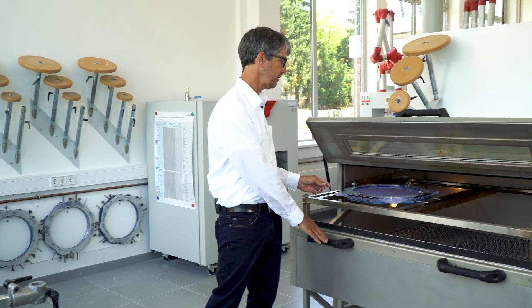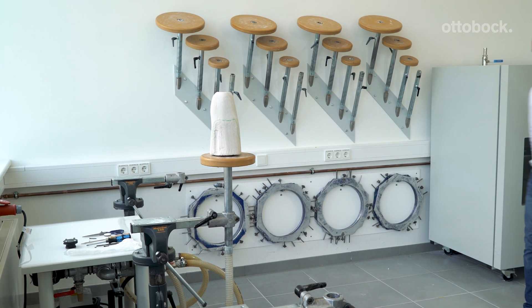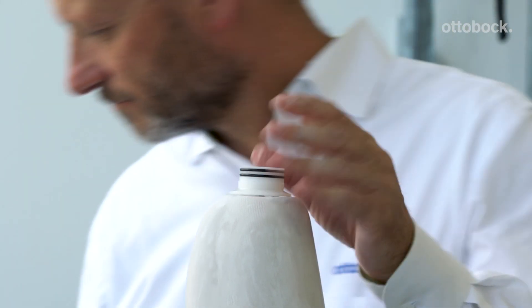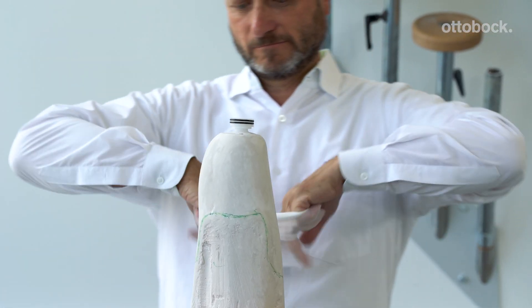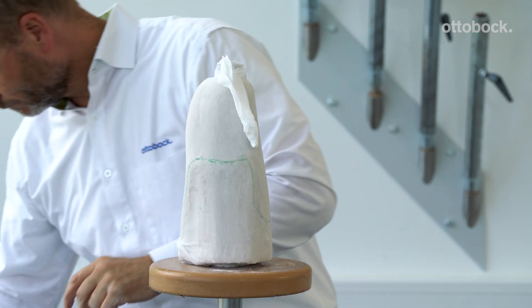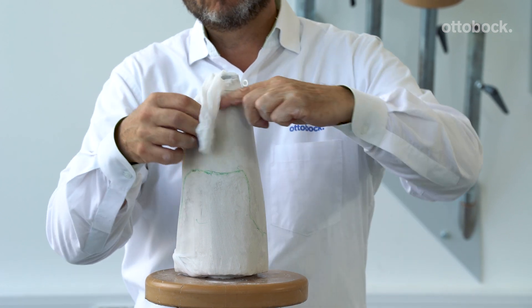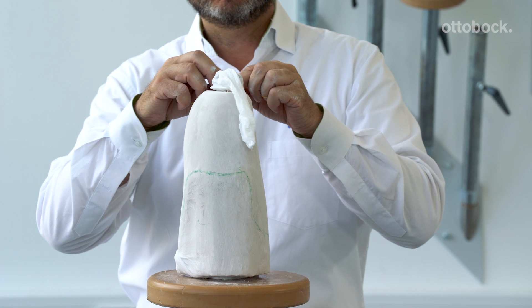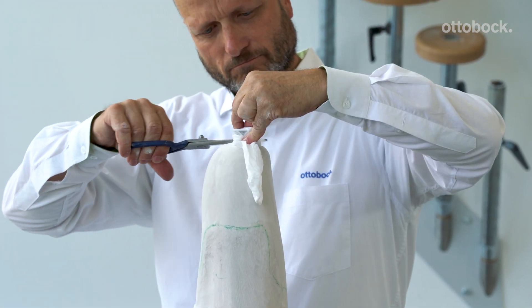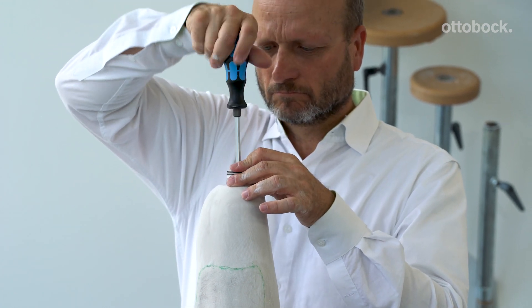We will use 12 millimeter thick Thermolyn stiff to thermoform. Now Kai will demonstrate preparation and fabrication of the check socket. Anchor the piston dummy loosely with a screw. Take a thin nylon stockinette and put it over the top of the plaster model and the piston dummy. Then take a small thread and tie off the nylon stockinette underneath the piston dummy and around the screw. Trim off all the excess nylon stockinette to expose the piston dummy. Finish securing the piston dummy to the plaster model.